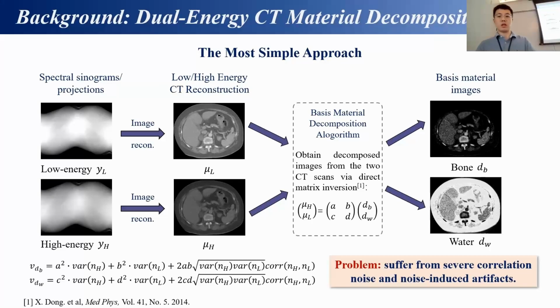So it can be seen that the noise in the material images is amplified during this decomposition process, which makes the image degraded.